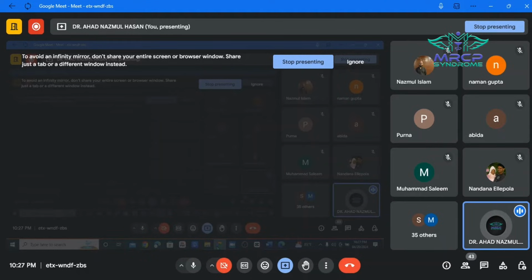So in case of T1 weighted image, the TR is usually 500 millisecond and TE is 14 millisecond. And in case of T2, the TR is around 4000 millisecond and TE is 90 millisecond. And in case of FLAIR images, the TR is usually 9000 millisecond and TE is around 114 millisecond. FLAIR means fluid attenuated inversion recovery. The FLAIR image is also similar to the T2 weighted image, but TE and TR should be much longer compared to the T2.